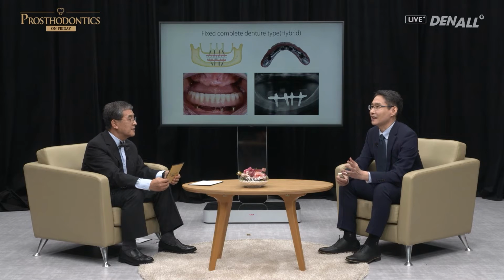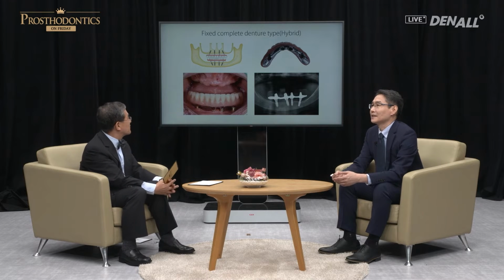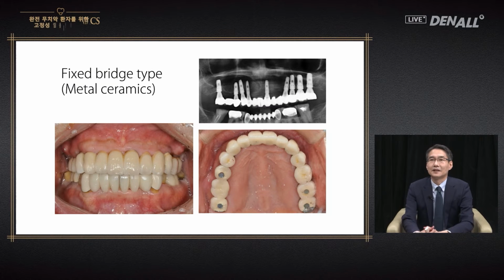This patient had 4 implants placed in the lower. The upper is a full denture. It was very difficult to place implants in the upper. Therefore, I treated the lower first. The patient is using the full denture very nicely, and I think the patient would be able to use it for the rest of her life without problem.